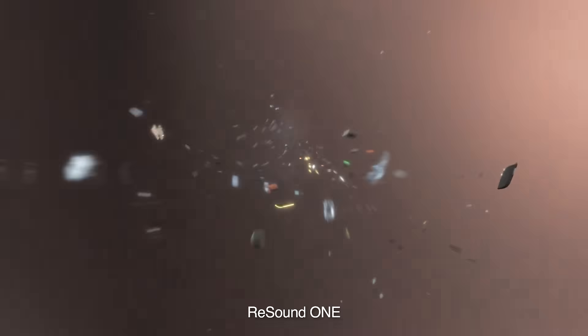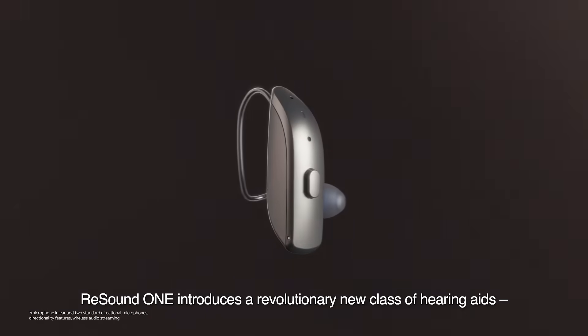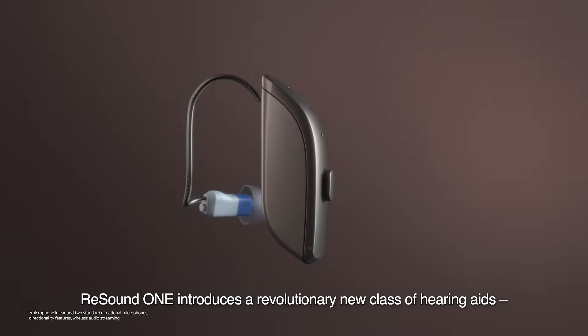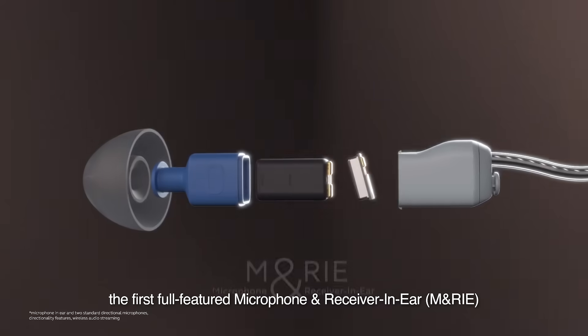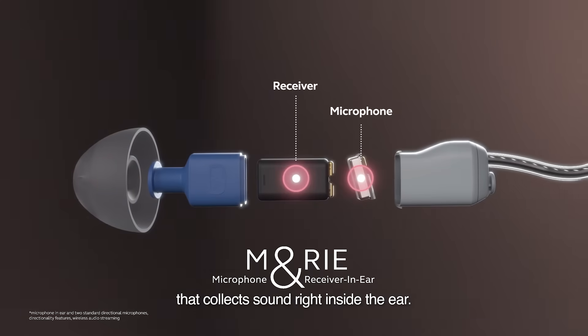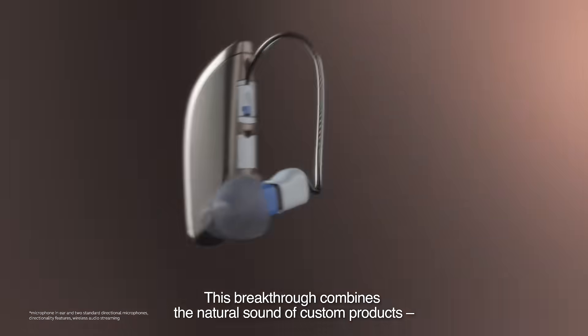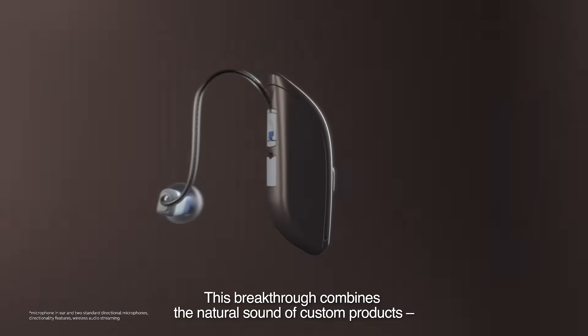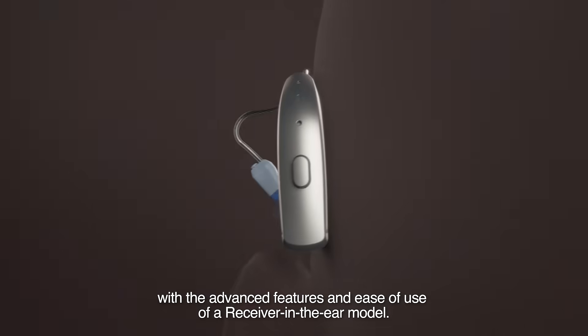That all changes with ReSound One. ReSound One introduces a revolutionary new class of hearing aids—the first full-featured microphone and receiver in-ear (M&RIE) that collects sound right inside the ear. This breakthrough combines the natural sound of custom products with the advanced features and ease of use of a receiver in-ear model.